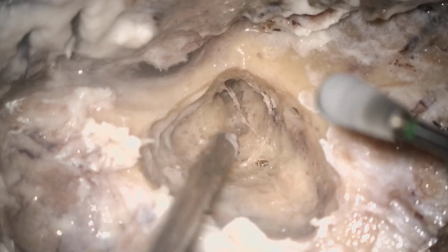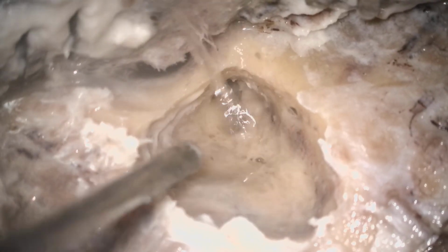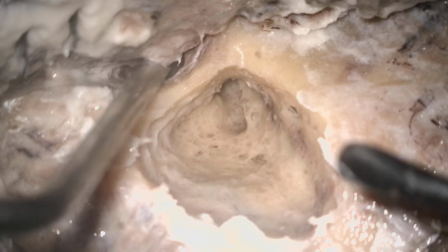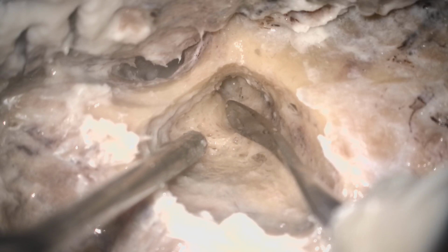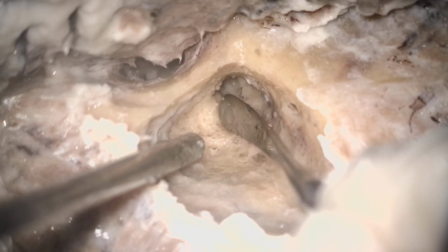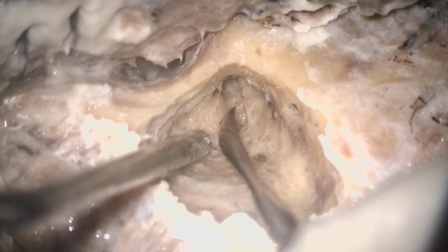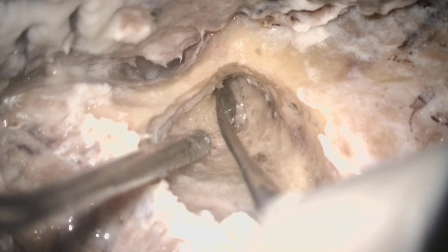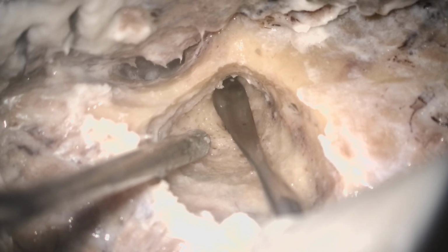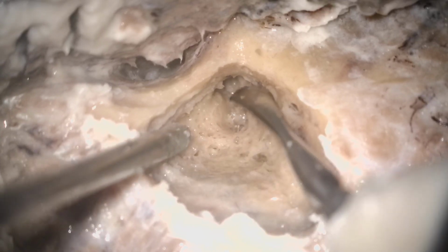So look, now we have entered the mastoid antrum, and what is the first landmark of the cortical mastoidectomy? In the mastoid antrum, we can visualize the lateral semicircular canal in the floor of the mastoid antrum. So this is the lateral semicircular canal. This is the first important landmark in the antrum cavity. So this is the mastoid antrum, this is the posterior epitympanic cavity, and this is the lateral semicircular canal. So this is part of the mastoid antrum.